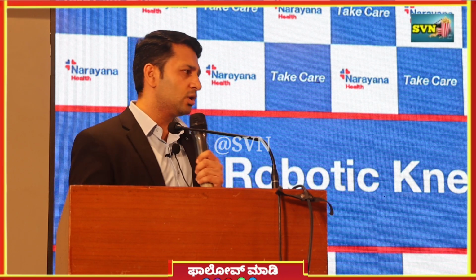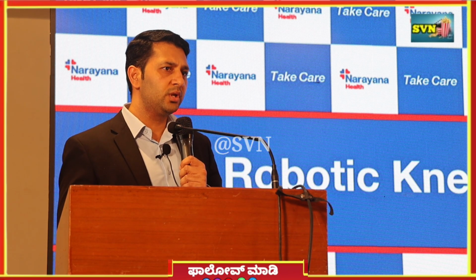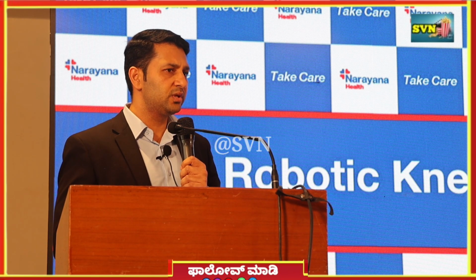There is a misconception that a single robot in medicine can do all the surgeries. No. Every specialty has its own robot. For example, there is a robot which does only abdominal surgeries, and the robot which we are talking about today is the robot which is only used for joint replacements. So today we are here to impress upon the importance of robotics in joint replacement.